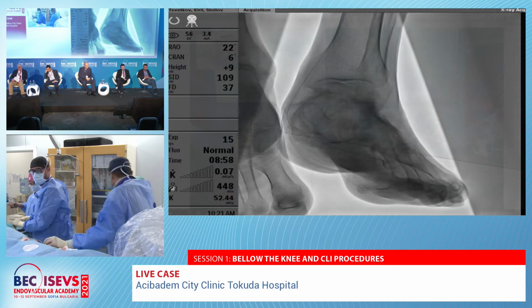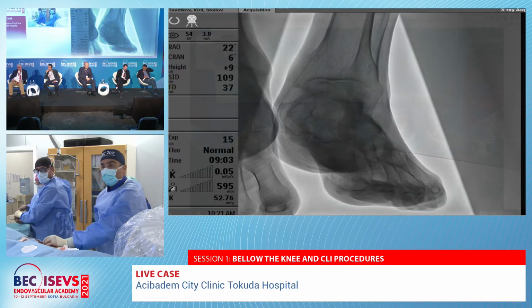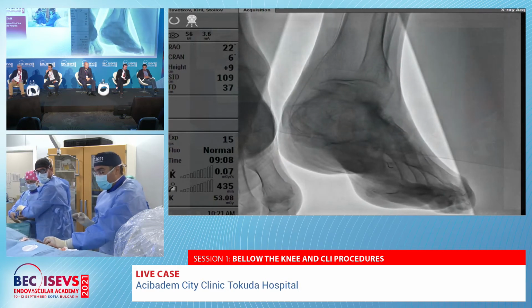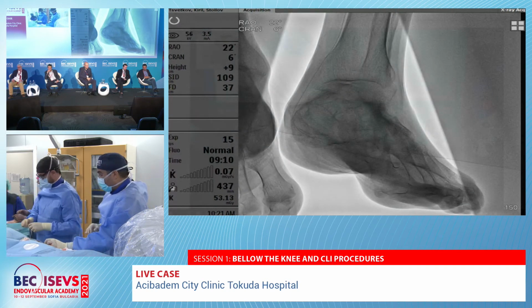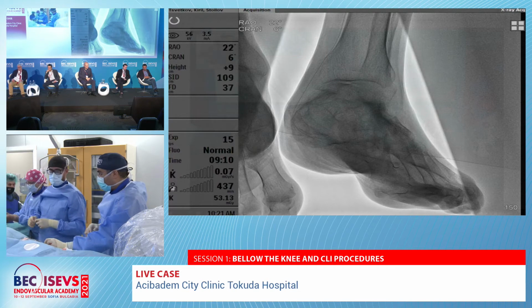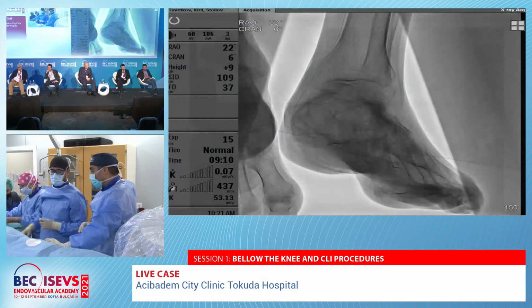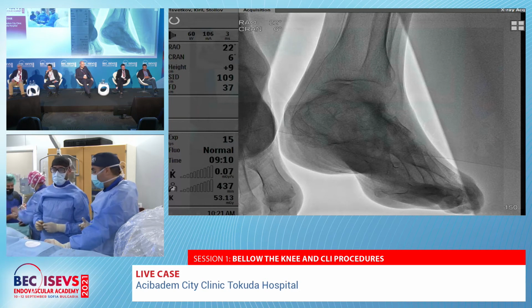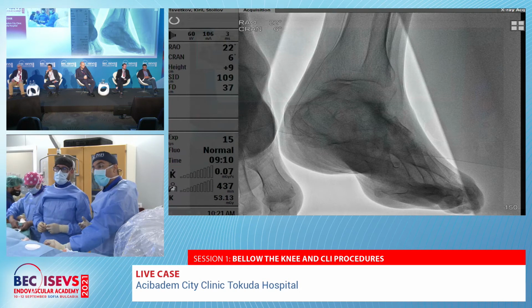So we're going to use, which one? The Paseo 14 to 140, just to do first dilatation to check what happens. The point is, it could be a very good reason why this reconstruction was occluded, that the outflow was not the best one. Only with a fibular artery with an occluded posterior tibial, it could be the reason. I'm only worried that the 014 guide wire won't give us enough support because we have difficulty passing through the thrombus with the supporting catheter.